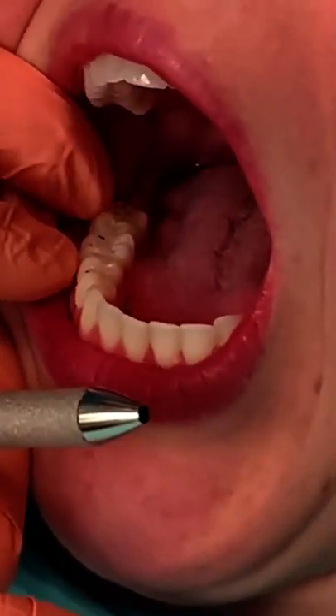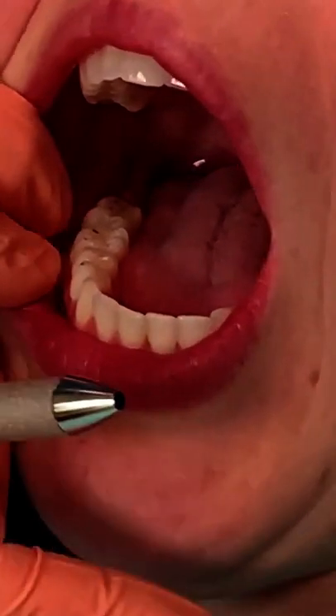I think that's okay. We got a little spot there, but I think that may be where she normally bites. Close your teeth together — how's that feel? Good. And then if this was your patient, you would proceed accordingly.